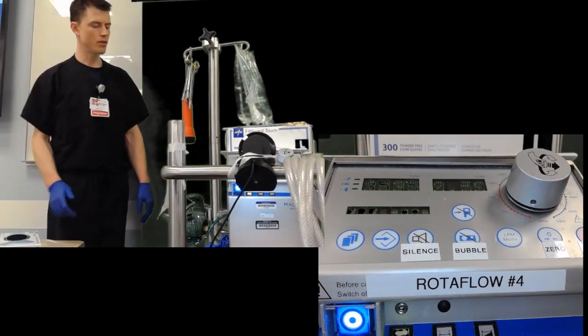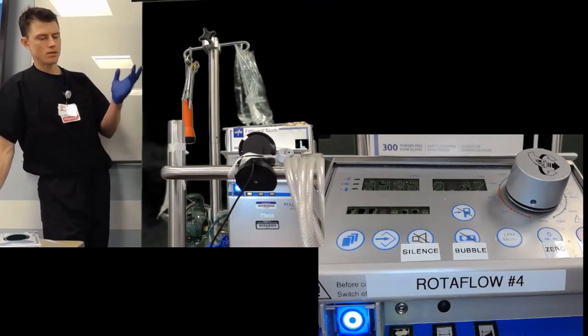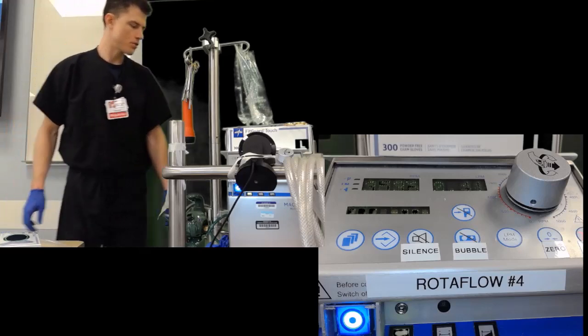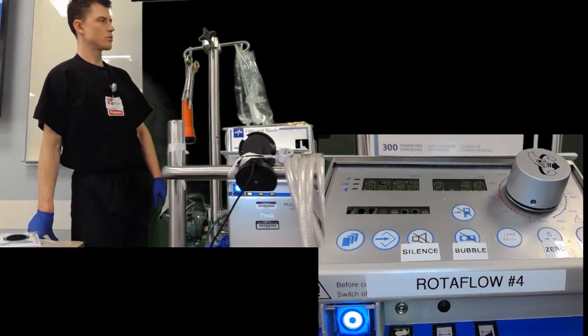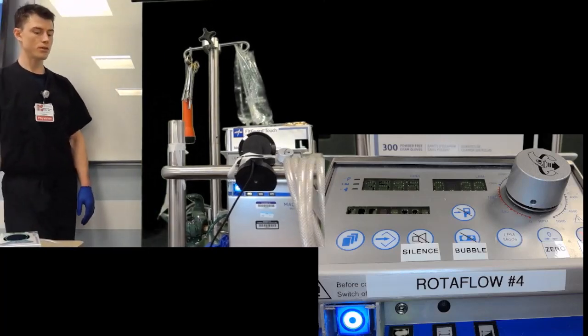So you've got your flow, let's say we're at 5 liters a minute. Actually, here's a troubleshooting thing. What's another reason why we have low flow? High RPMs. Well, a kink. A kink, right? So run your circuit.